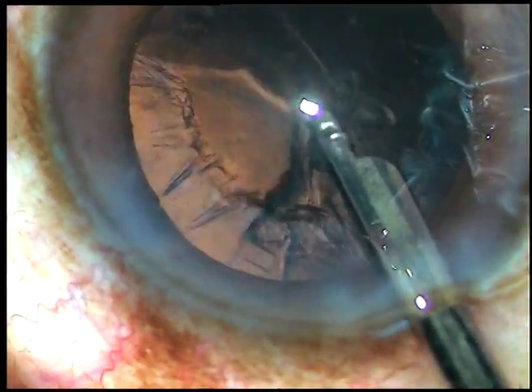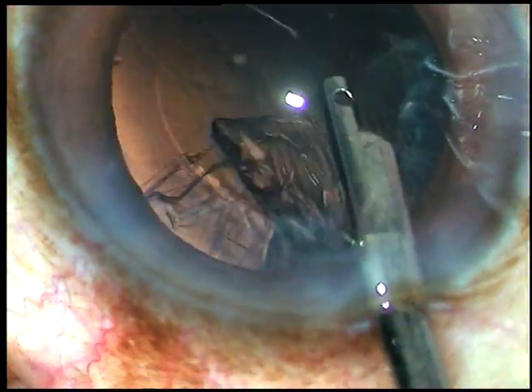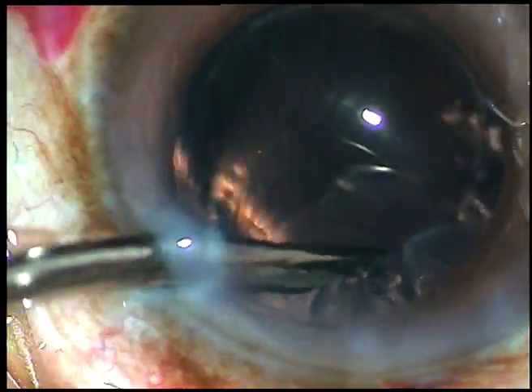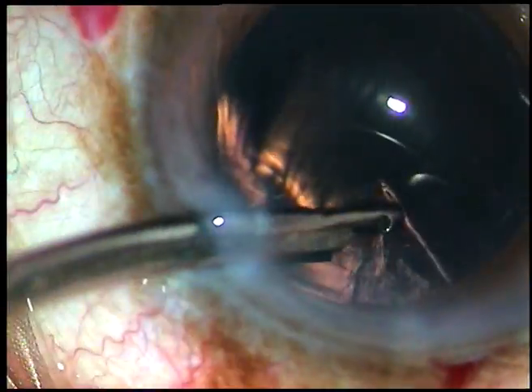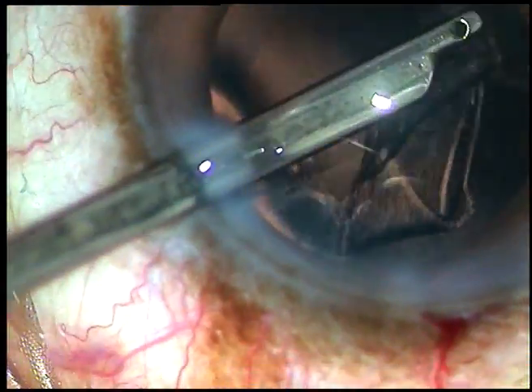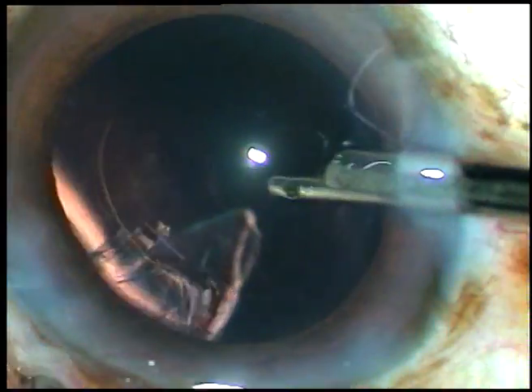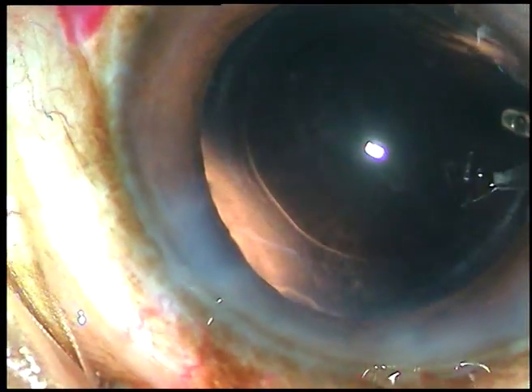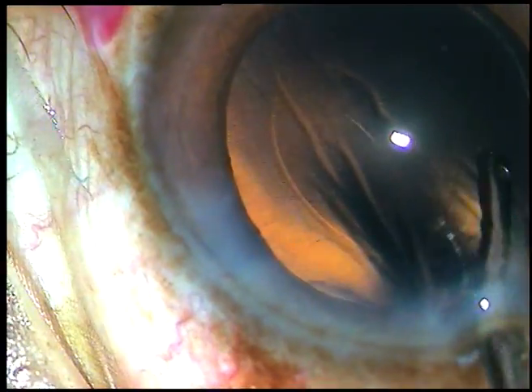We can use bimanual IA or coaxial IA, whatever we like, for cortical cleanup. With this instrument the side port required is a little larger. We can place the side ports about three clock hours away to reduce the astigmatism produced by the main incision. This is the final bit of cortex and now cortical cleanup is complete.